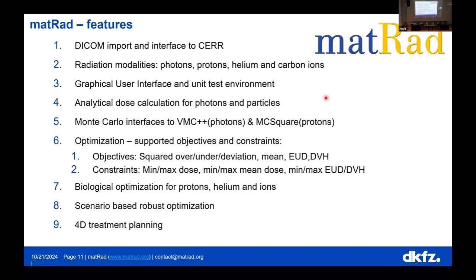Our algorithms that we use today are all analytical pencil beam algorithms. That's just because of the computational needs. Of course you could run a Monte Carlo algorithm, but we heard before Monte Carlo can be agonizingly slow, and especially when you use open source software, you use maybe Geant4 to simulate, it's a really long time to wait for ions. So we use analytical dose calculation.